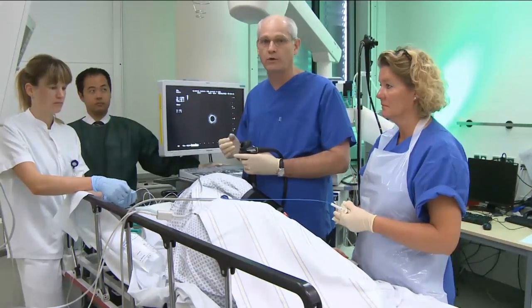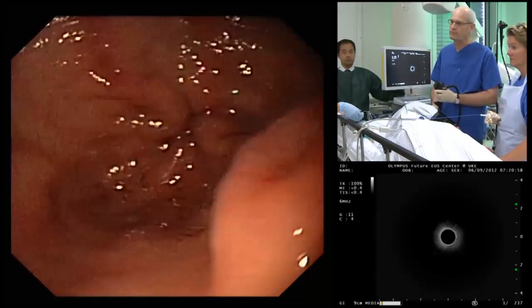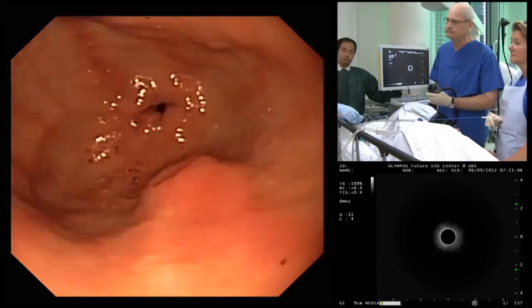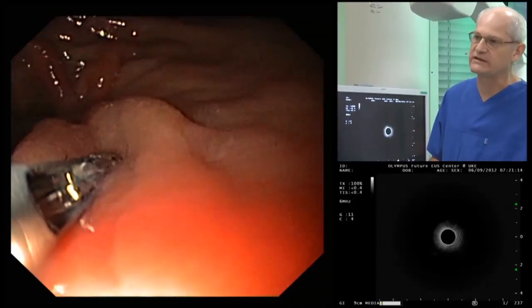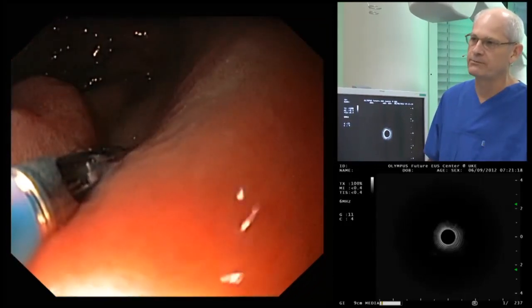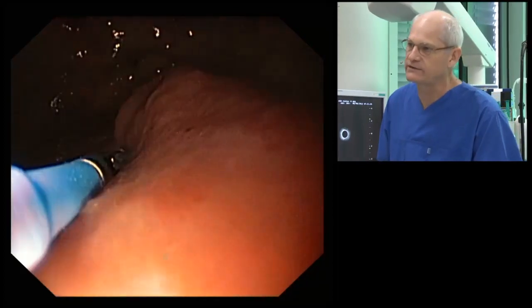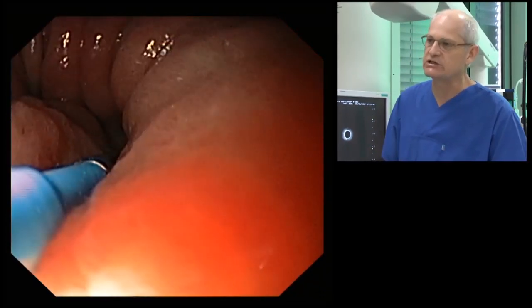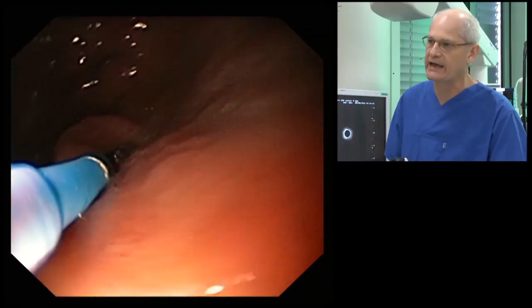It is my general practice on a submucosal mass in the stomach to take a brief look with a regular endoscope, mainly to palpate the lesion. You can see here that this is umbilicated and located in the antrum. I use closed biopsy forceps to assess whether the lesion is soft or firm, and whether it's mobile over the gastric wall. It is relatively soft and mobile, suggesting it is located in the submucosa and not attached to the muscularis propria.